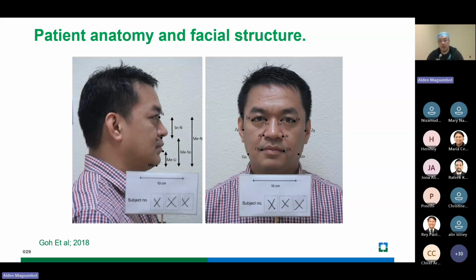However, this study advises that the nasal mask should be the first choice during CPAP initiation. This is due to their superior adherence and efficacy, while craniofacial features like the jaw, the face, proportions might influence mask fit and adherence. They should not be the sole deciding factor. Now, ultimately, the mask choice should be a balance of anatomical considerations with the efficacy of treatment and patient comfort.